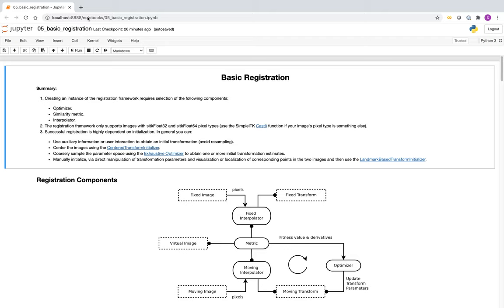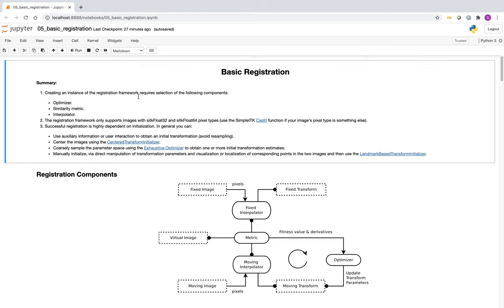Welcome to the registration portion of the tutorial. In the first part of this video we will go over the various registration framework components, learn how to configure a registration pipeline, the importance of initialization, and experiment with various initialization approaches. In the second part we will go over options for non-rigid registration and learn how to evaluate registration results. Finally, we conclude with a specific clinical application: construction of long bone panoramic images. Let's start looking at the notebook.